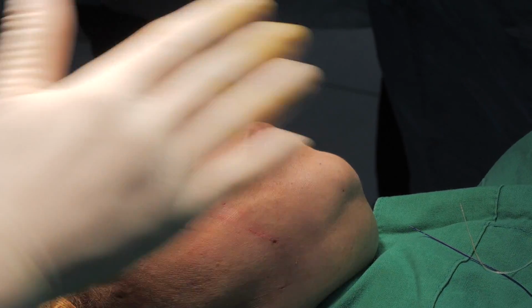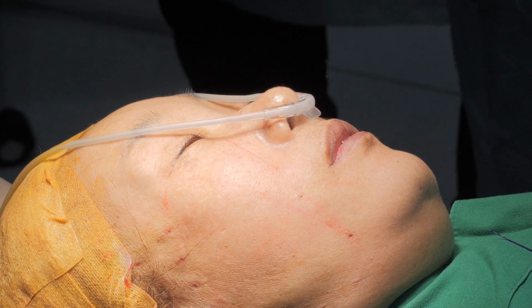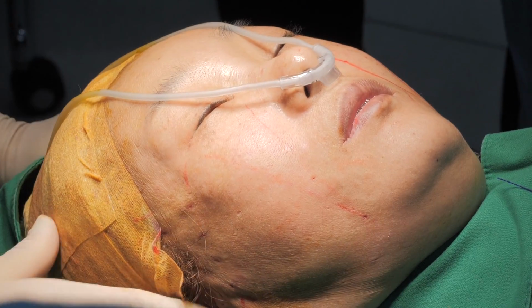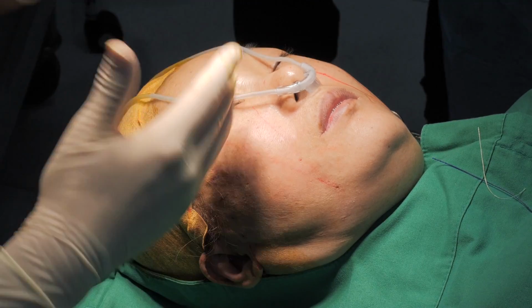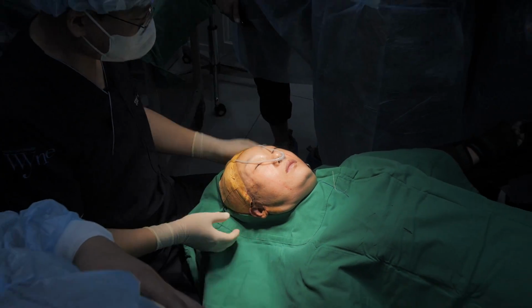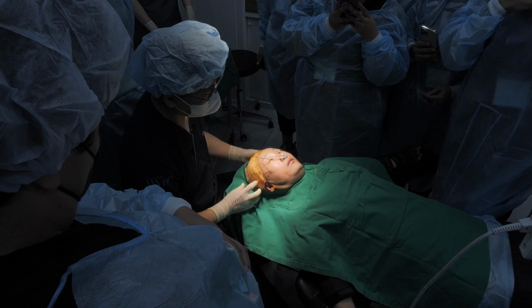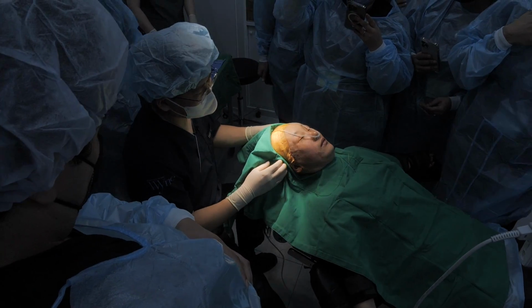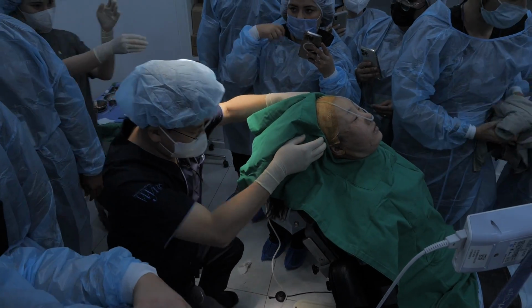Okay, this is the end of my presentation on the right part. Thank you. So let's compare. But the result is not so predominant. You know, Korean patients have very thick skin, so it's very heavy. It's not so predominant.